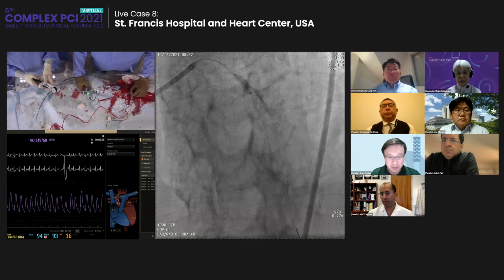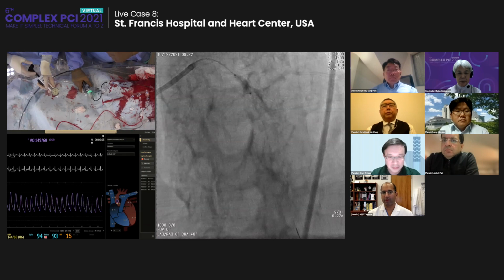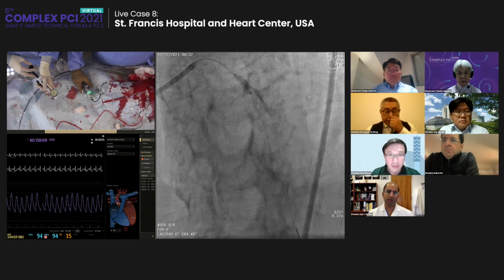And then finally, the points made about the angulation. Pull back a little bit. Because with wire bias and angulation and an aneurysm just beyond it, those are cases where even the most experienced atherectomy users are going to have a little bit of trepidation. So I think this is a great approach.